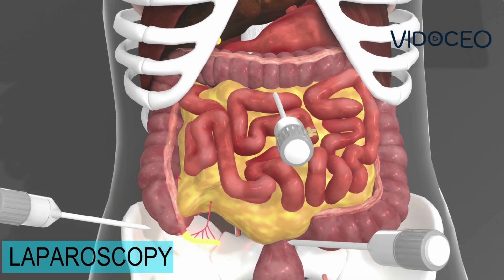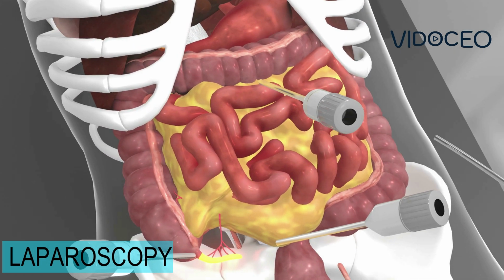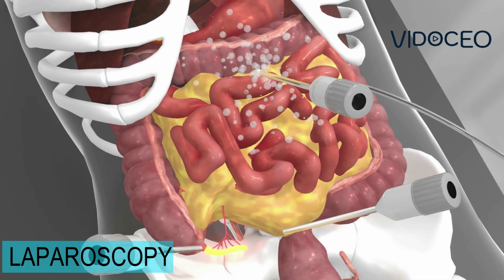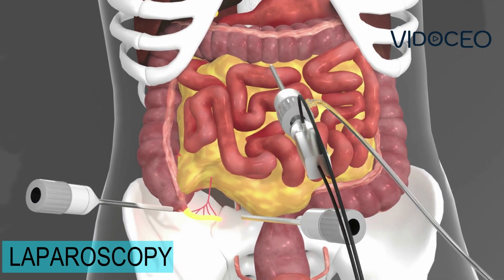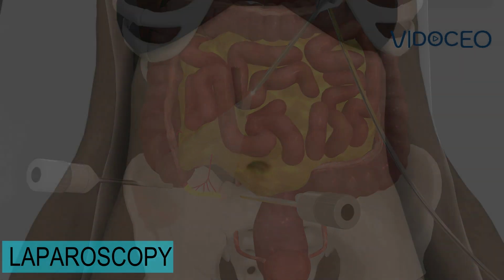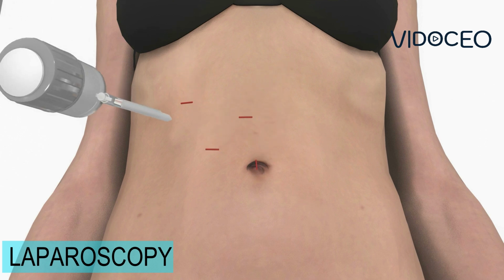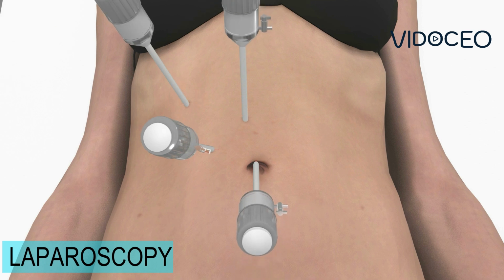Laparoscopic surgery, also called minimally invasive surgery, is a technique for surgery that uses small incisions on the abdomen. This decreases postoperative pain and improves recovery. The patient will undergo general anesthesia because the abdominal muscles must be fully relaxed. The surgeon will make several small 1 to 2 centimeter long incisions in the abdomen, place long skinny tubes called ports through these incisions and through the abdominal wall muscles until the tip is in the abdominal space.